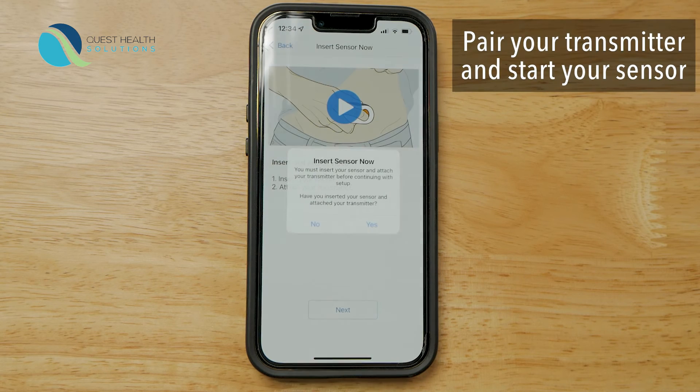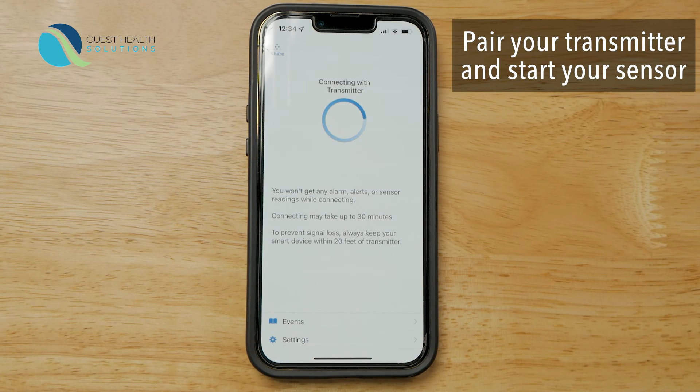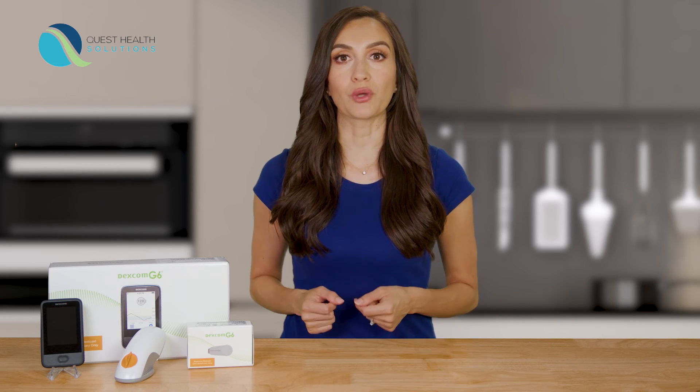You'll reuse the same transmitter for 3 months. Once your transmitter is attached, you can swim, bathe, and shower like normal. Now it's time to pair your transmitter and start your sensor. Wait for your transmitter to pair, then tap the start sensor button. Now your sensor warm-up has begun. The warm-up will take 2 hours to complete. After your 2-hour warm-up, you get your first sensor glucose reading.